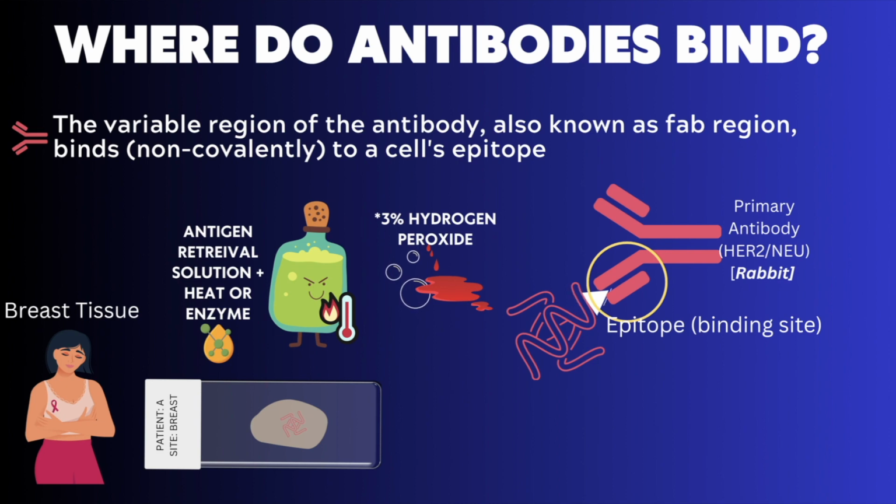Typically, antibodies are drawn in cartoons as Y-shapes. The yellow circled region is known as the Fab region, and that is the location at which the binding occurs. I should also note that this bond isn't overly strong, as it is a non-covalent bond. We will get into binding specificity and other regions of the antibody in future lessons.